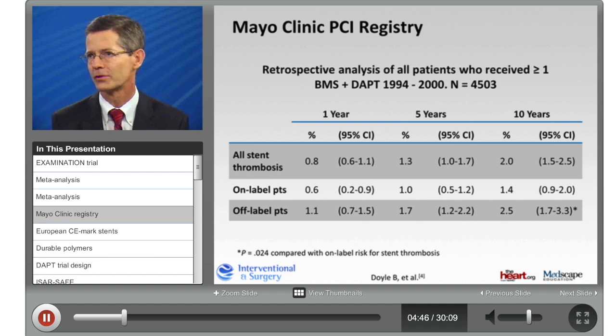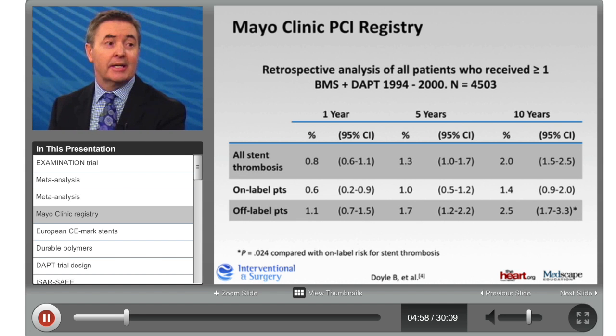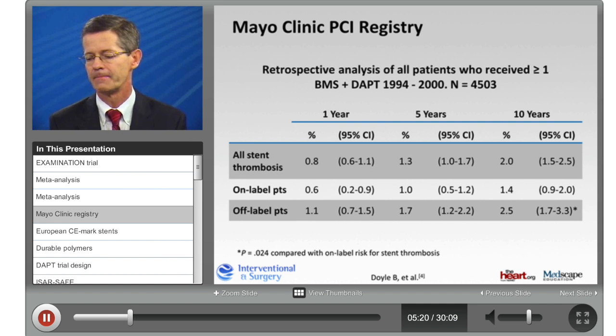Right. And I think we're all focused on very late stent thrombosis, and this issue of neoatherosclerosis is something that down the road we're going to face. Yeah, that's right. Now, I think to Dean's point about bare metal stents having very late clinical events, part of that is neoatherosclerosis, and it may be due to all of these issues that we've discussed previously about stent strut thickness, malapposition, all of those things that would alter endothelial function because of changed shear stresses. So there's a combination of things that lead to late clinical events. Do you agree? Yeah.